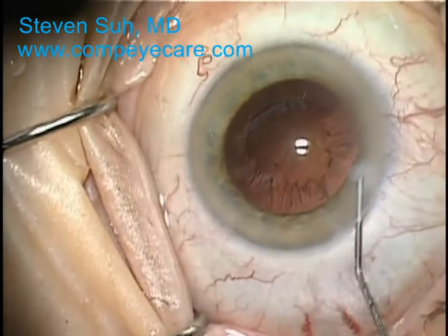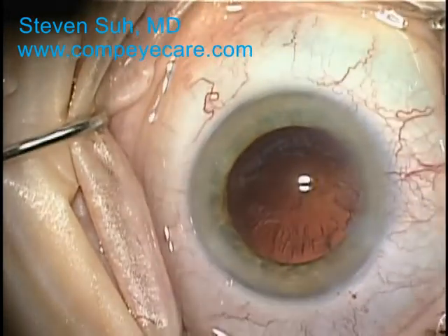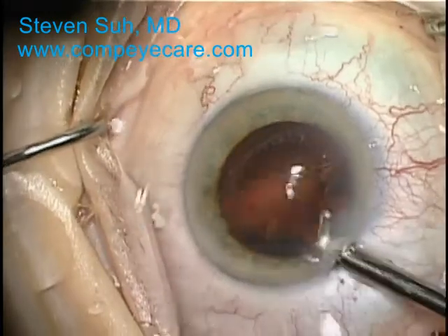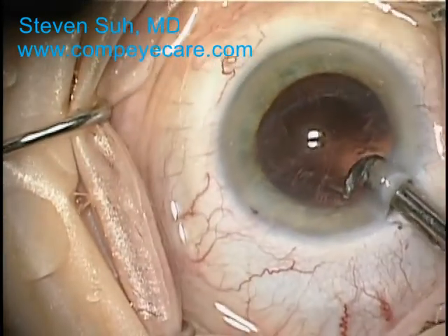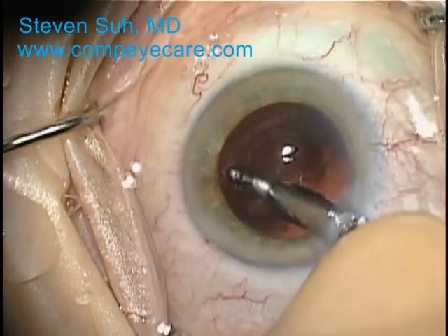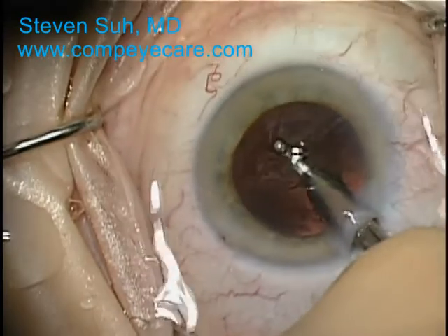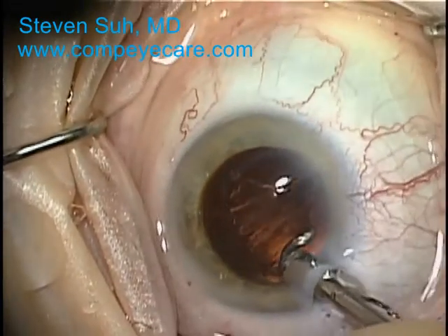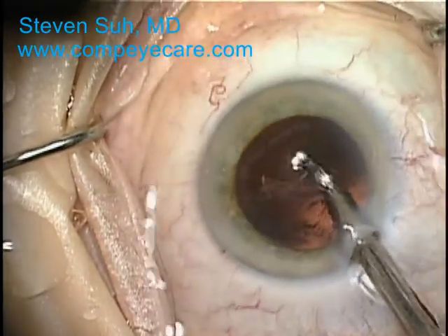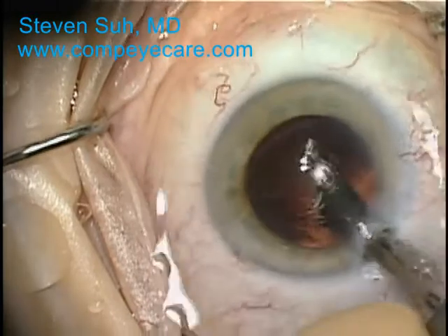So after the nuclear material is removed, the automated irrigation aspiration unit, or I/A, is used to remove the cortical material, which is adherent to the inside of the capsule. So this is the layer between the nucleus and the capsule. Unlike the phacoemulsifier, ultrasonic energy is not needed because this material is soft. And this is also controlled by pushing down on that foot pedal.